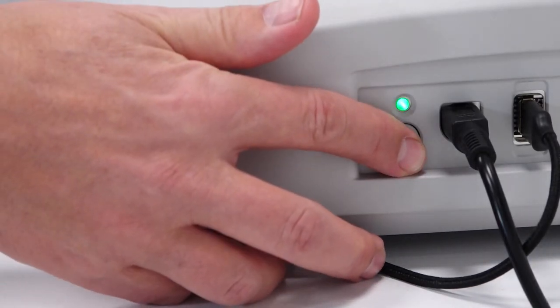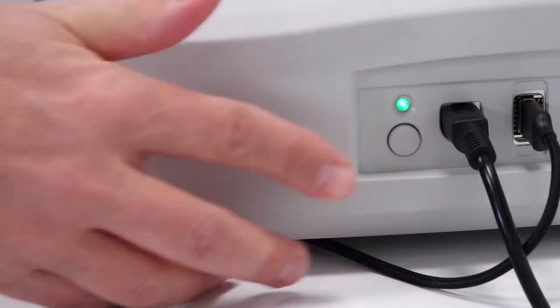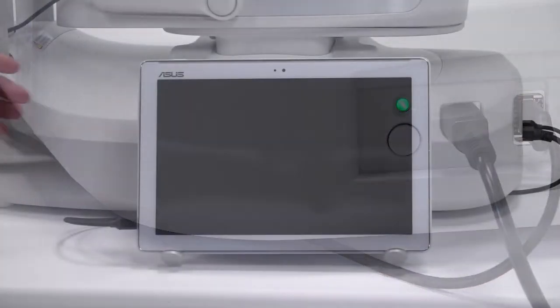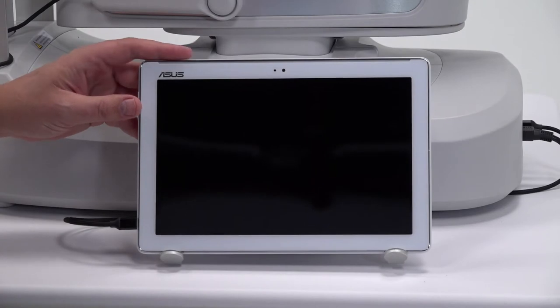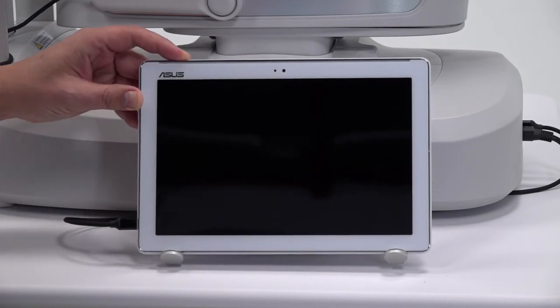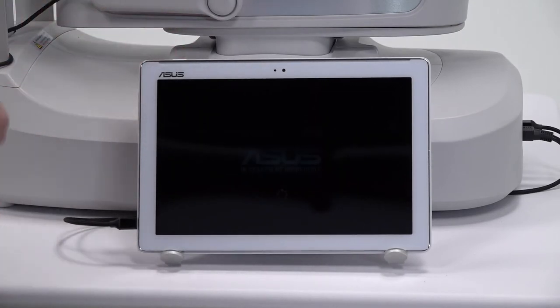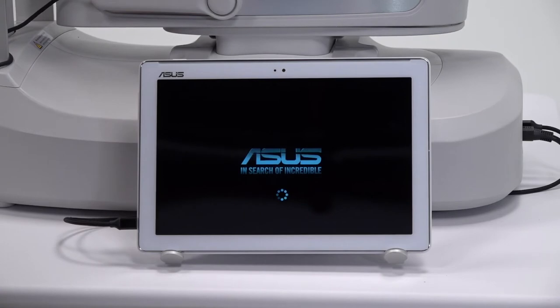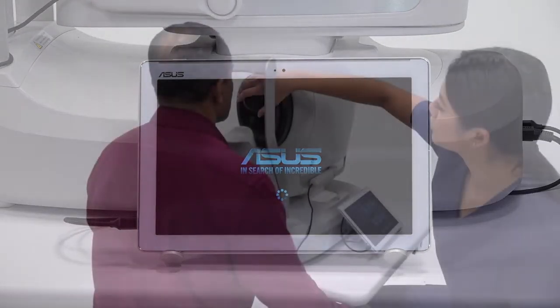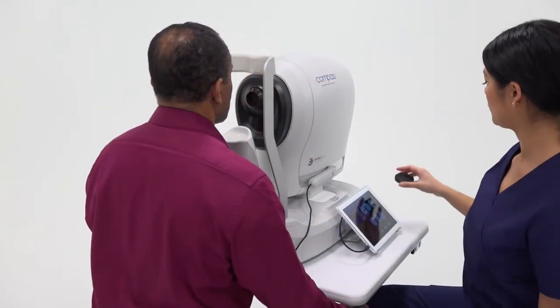Turn on the compass by holding the rear power button for two seconds and power on the tablet by pressing the power button in the top left corner. Remove the lens cap.